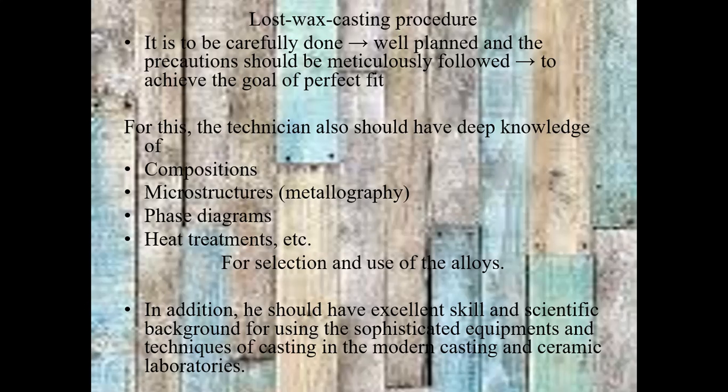Now, I've told that the procedure is known as lost wax casting procedure. It is known as lost wax casting procedure because the wax pattern is fabricated and then this wax is burned out to get the mold space.